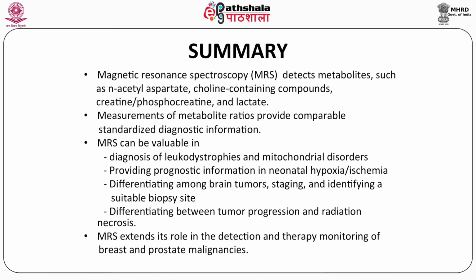Magnetic resonance spectroscopy or MRS detects metabolites such as N-acetyl aspartate, choline containing compounds, creatine, phosphocreatine and lactate. Measurements of metabolic ratios provide comparable standardized diagnostic information.